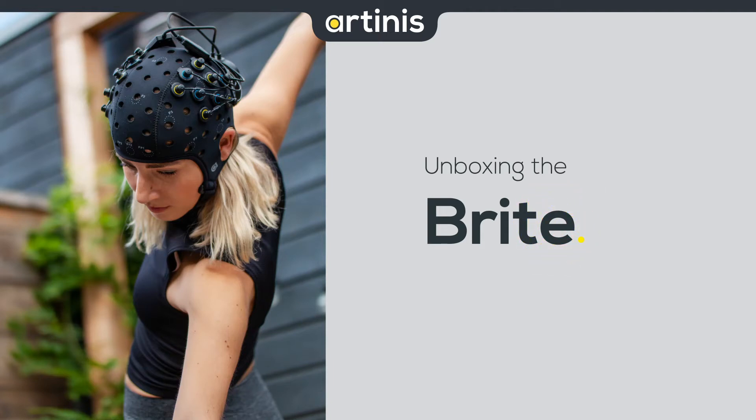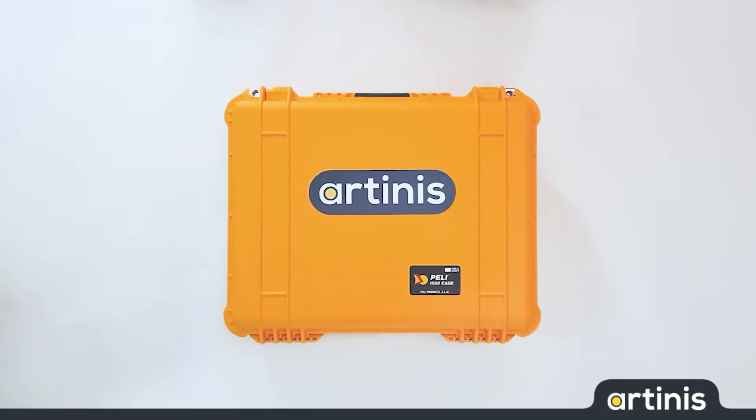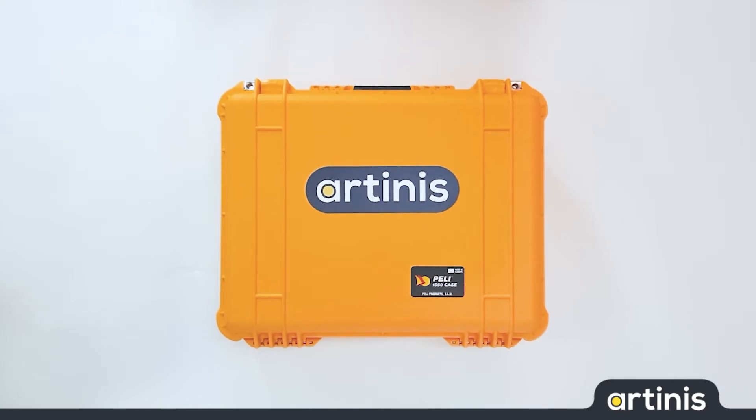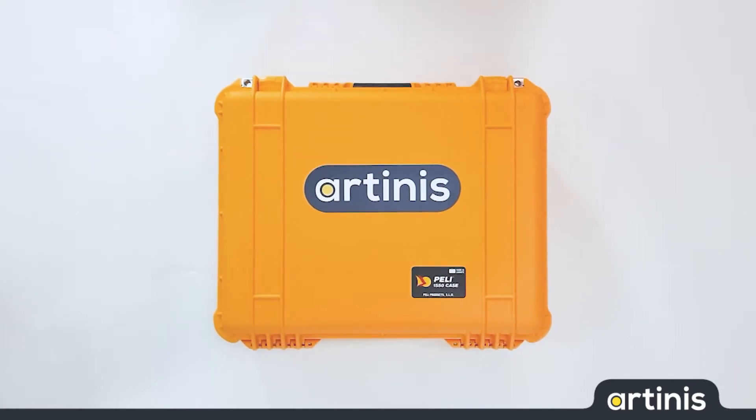Hi, my name is Martina from Artinis Medical Systems. In this video I would like to show you the content of a Brite package. All of our NIRS systems come in a very sturdy bright yellow Peli case. This case keeps the system safe and makes it easy to carry around.